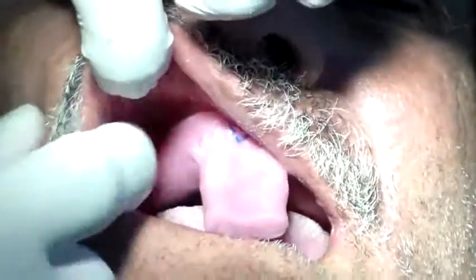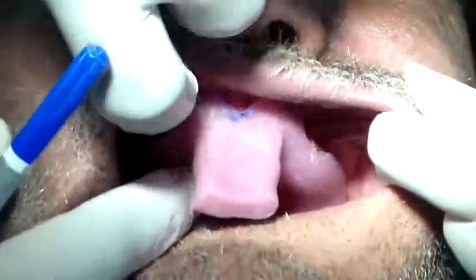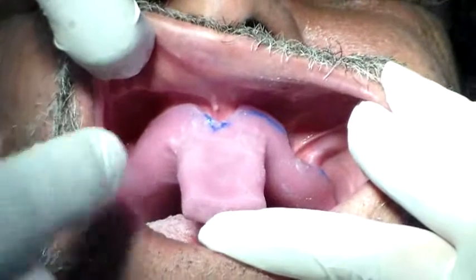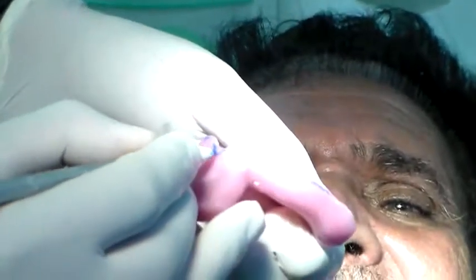When you come to this side also, if you pull it up like this, it looks like there is space. But if you pull it out rather — just hold here — you see contact. The phrenum is open and the posterior is all right. So I'm not going to do any other corrections. Just going to open it up a little bit here, in this region. It will open up freedom. That should be it.